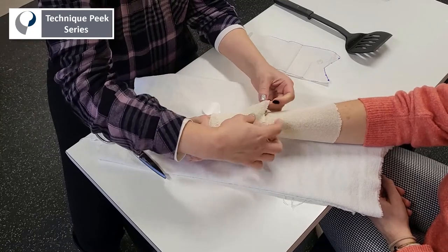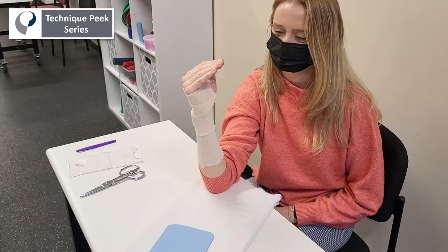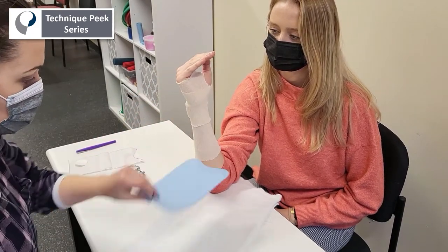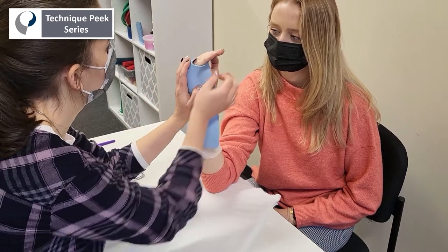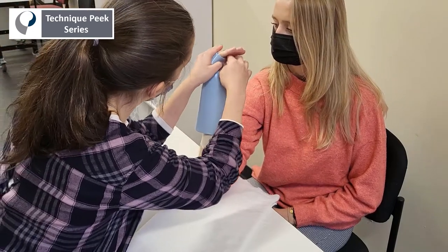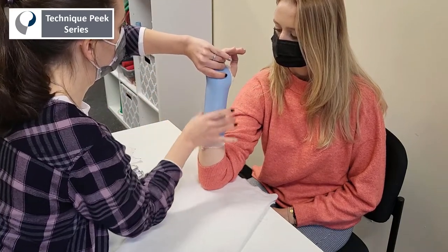For molding, have the patient with their elbow bent and their hand in the intrinsic plus position. The intrinsic plus position is very important to prevent tightening of the collateral ligaments, which could result in inability to flex at the MCP joint after a prolonged immobilization period. You can also see the therapist has slightly bent the patient's elbow towards their body so that gravity can assist and the material is not falling off as you're trying to mold it.